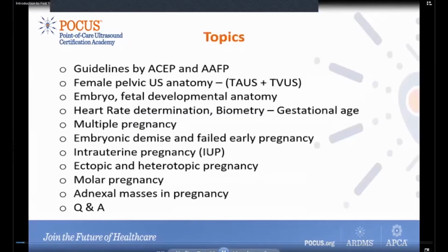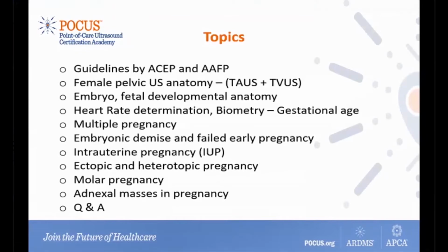Here is the list of topics that we'll be covering today. We'll go over this in detail in the next couple of slides, and towards the end we'll also have a Q&A session, so you'll be able to submit questions and I'll be happy to answer.